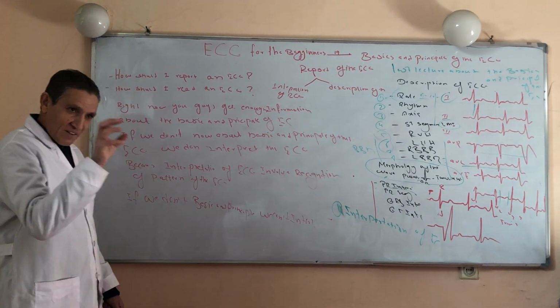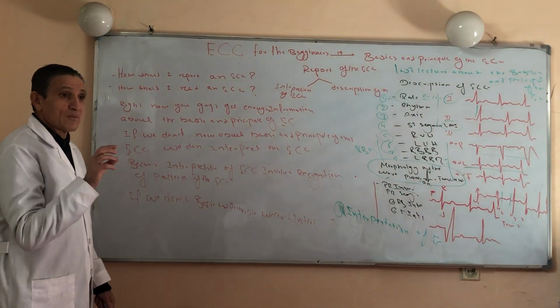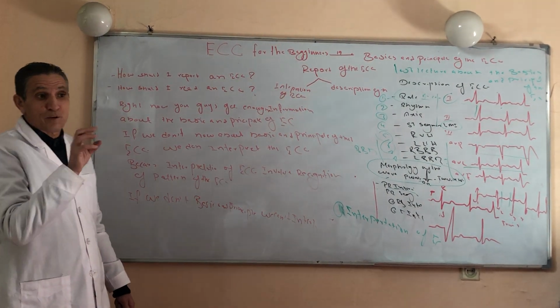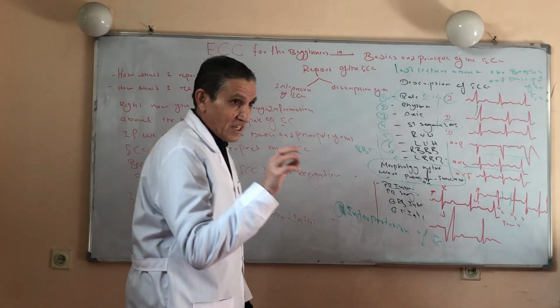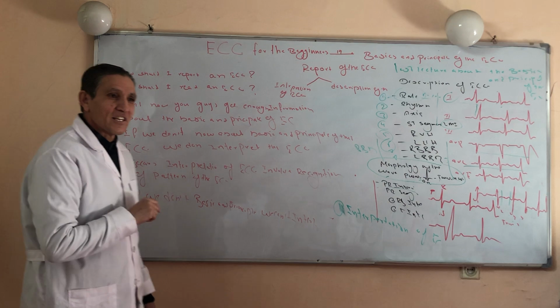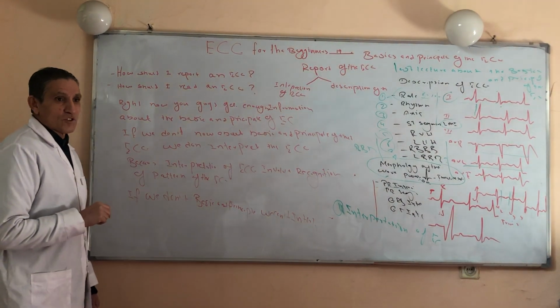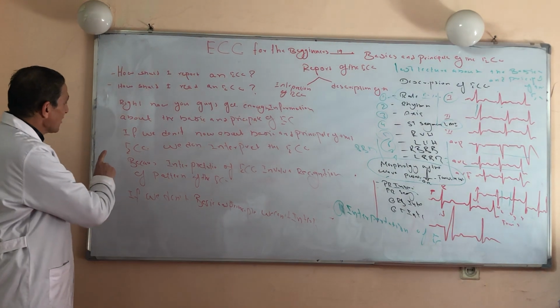Remember, right now you have enough information about the basics and fundamentals of the ECG. If you don't know the basics and fundamentals of the ECG, we can't interpret the ECG properly, because interpretation of the ECG involves recognition of the pattern of the ECG. So this is very essential.